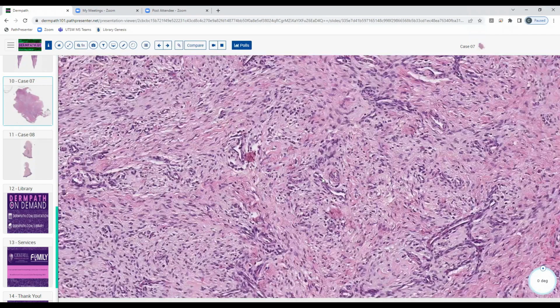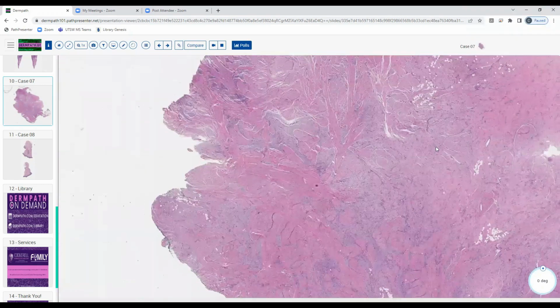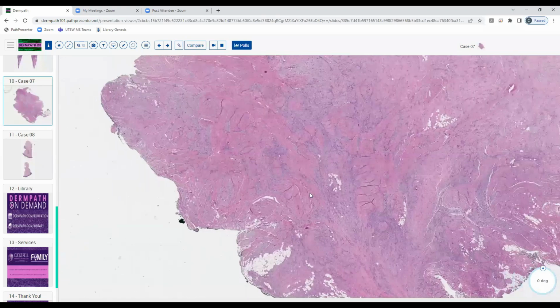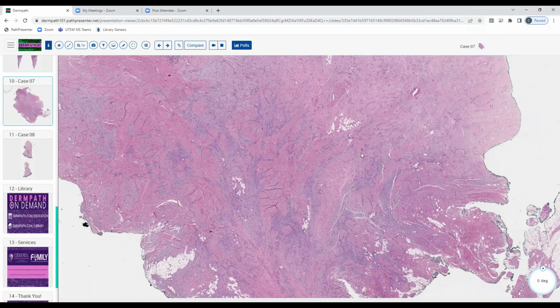On the trunk, or extremity, for example? If it was on the extremity, maybe infantile digital fibromatosis. Well, those usually give a little different pattern. They have these hyaline globules at the tips of these little spindle-shaped cells.